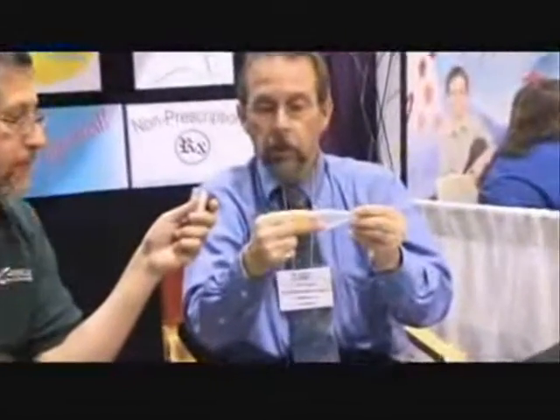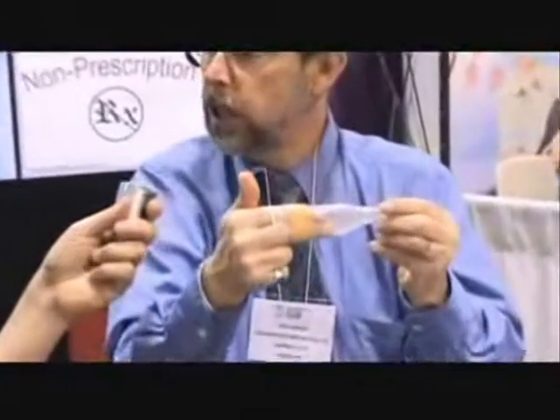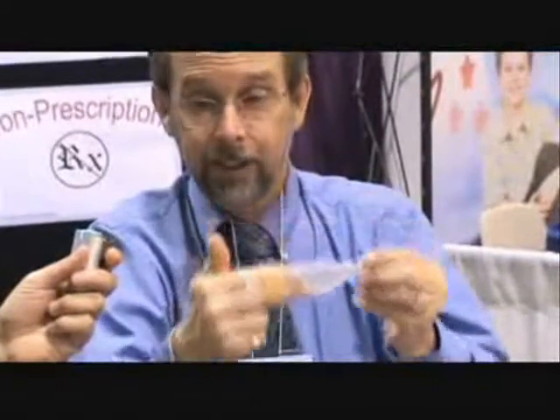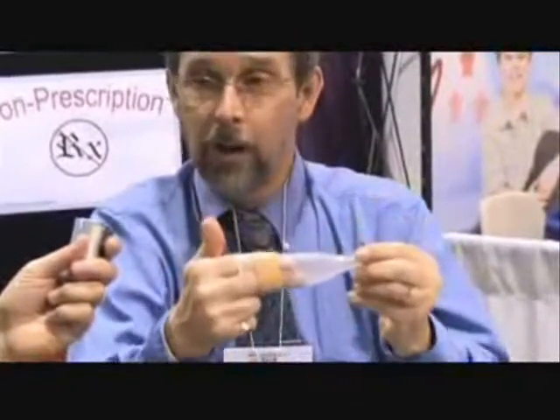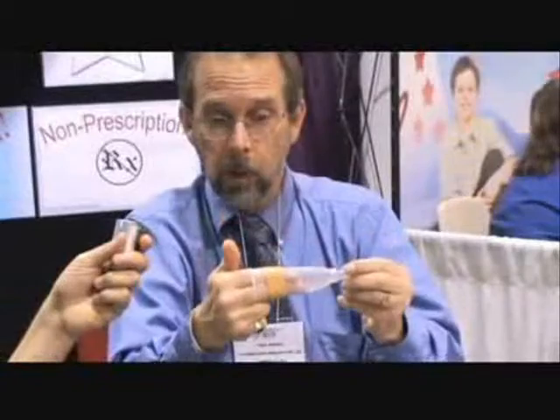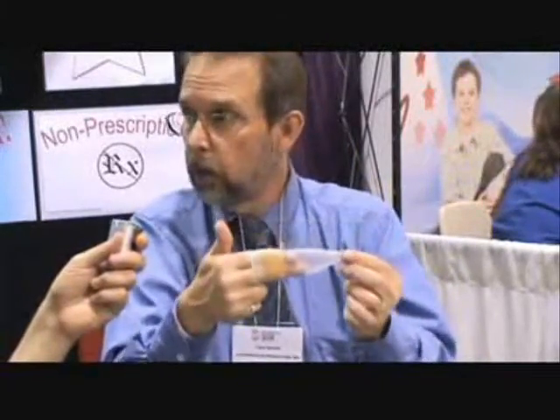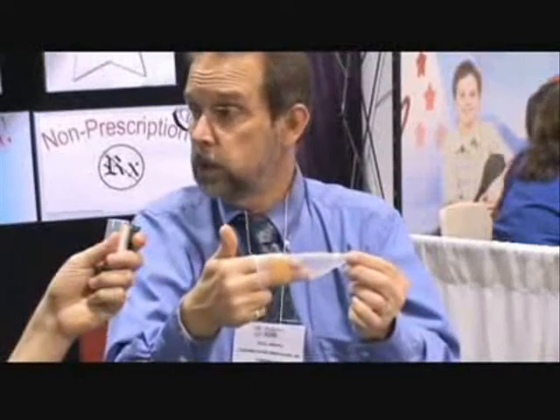What happens to the male during the course of a day is the male changes sizes. In cold weather, you get smaller. You'd go into water, although you don't use it in water, you get smaller. Post-urination, the penis gets smaller. Spontaneous erection happens. So this will allow for all those accommodations of all the different sizes during the course of the day for a male that they normally go through and don't even realize it.